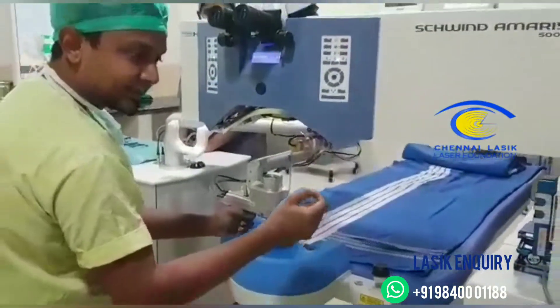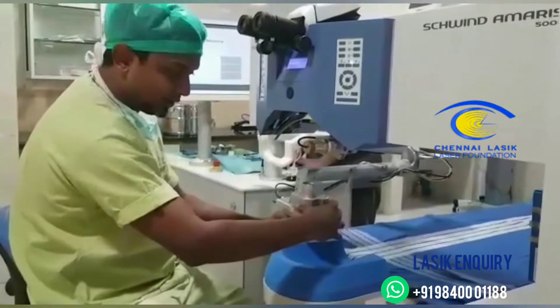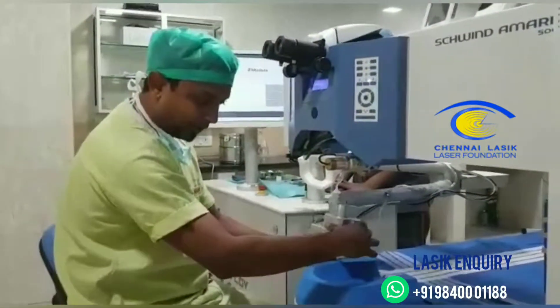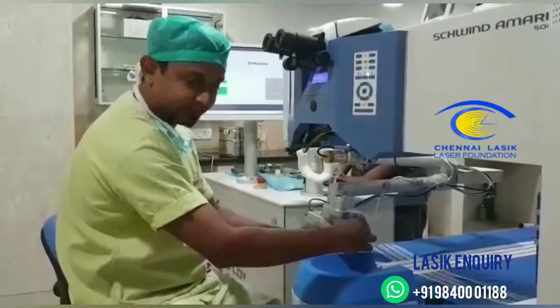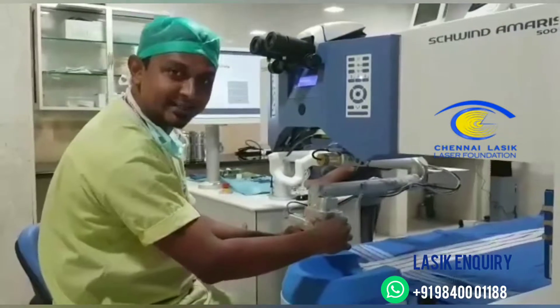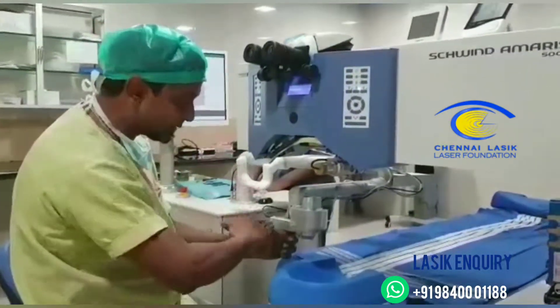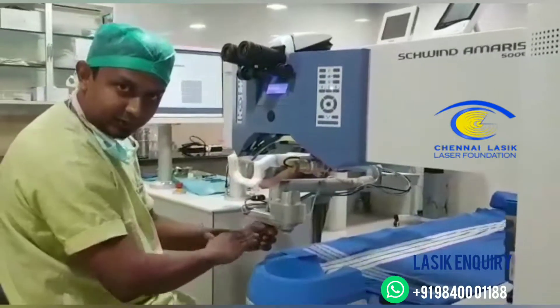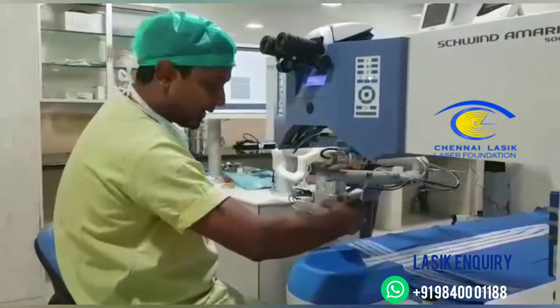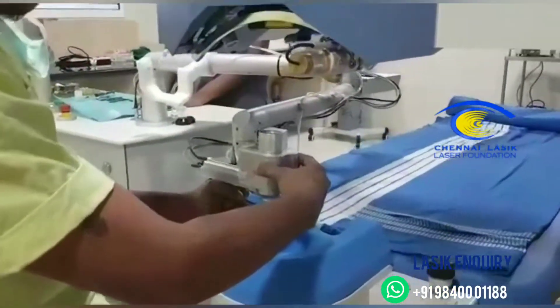Once you applanate, if there is a small area inferiorly that is not yet applanated, you can either move the machine inferior, superior, or temporal depending upon the suction, or you can ask the patient to move their eyes in that particular direction. Keep the machine parallel to the ground level, hold it with both hands, and applanate as simply and easily as possible.